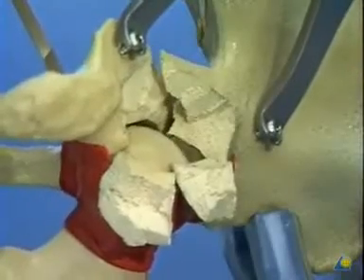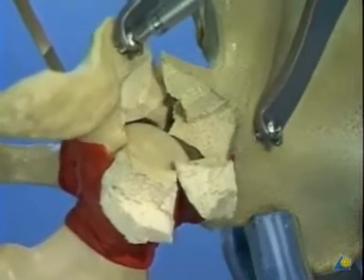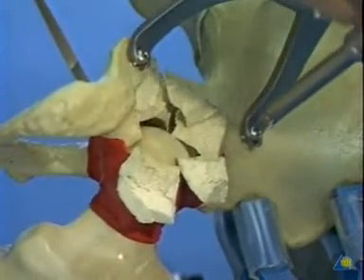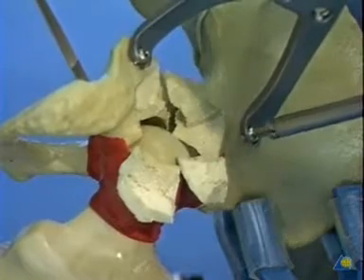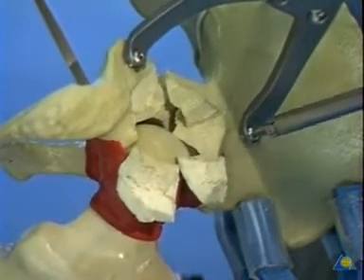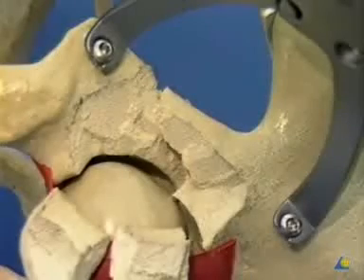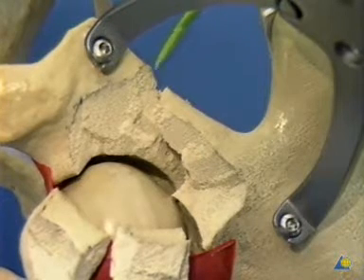The screws are not completely tightened, so that the bone fragments may rotate underneath the reduction forceps. We will now attempt to reduce the transverse fracture.